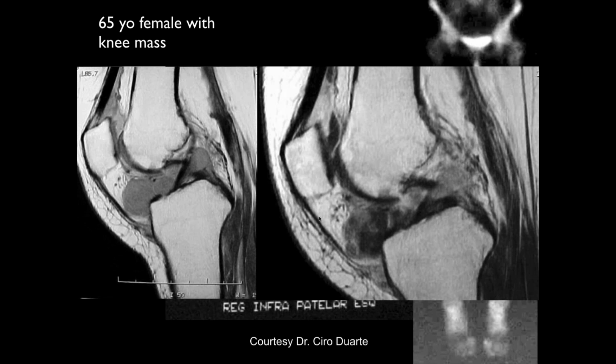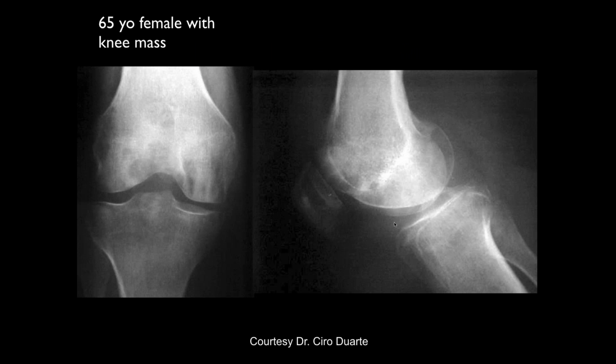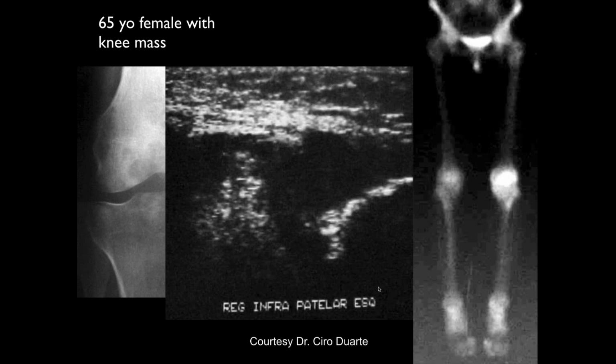This goes all the way to the posterior compartment. Well, we know that. And we know from the radiograph there's no calcification in that area that I can recall, or was there? Well, again, as John was saying, we really don't have good visualization. It's hard to say.